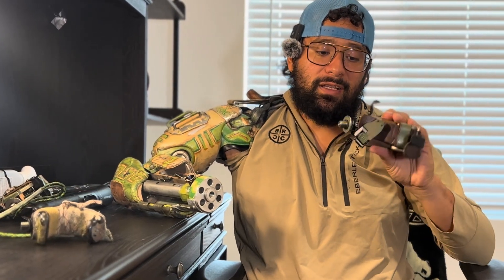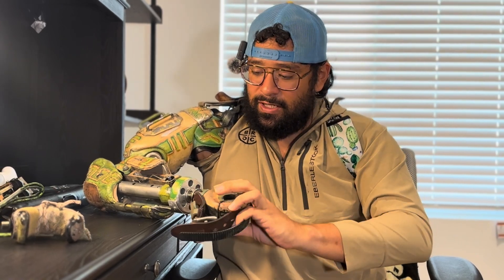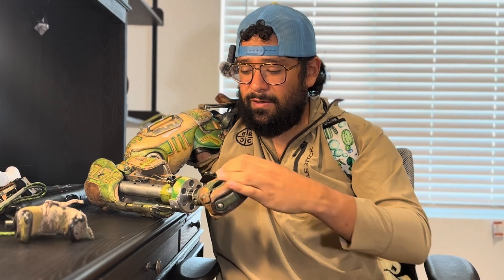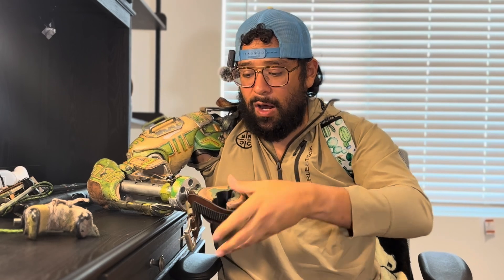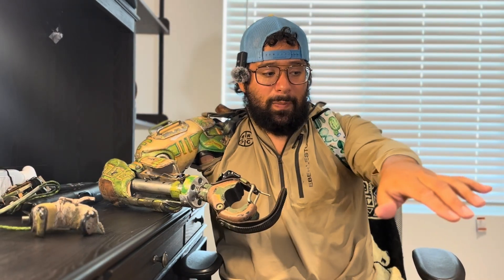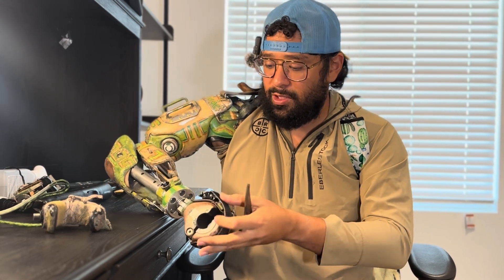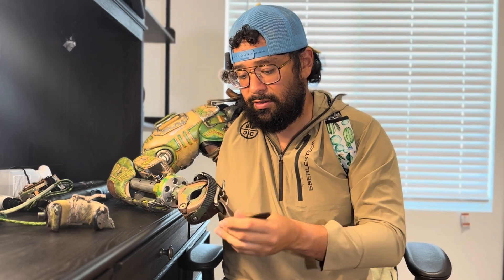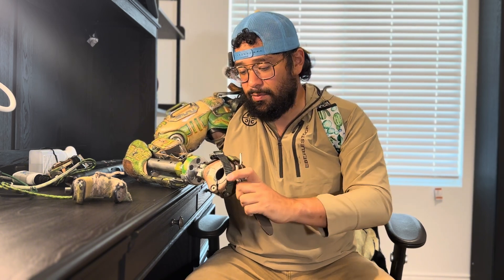I'm going to try using this one, which has a little bit of wrist movement to it which helps. I modified it because this hand was actually made for kayaking — that's what I've seen a lot of people use it for. It cannot take the power or torque of kayaking for me because it was made for below-elbow amputees, and below-elbow people relieve a lot of the tension by moving their elbow. So I would pop the little M2 clip off easily, so I replaced it with a leather belt and reinforced it with an M2 clip on top, which doesn't break or pop off.